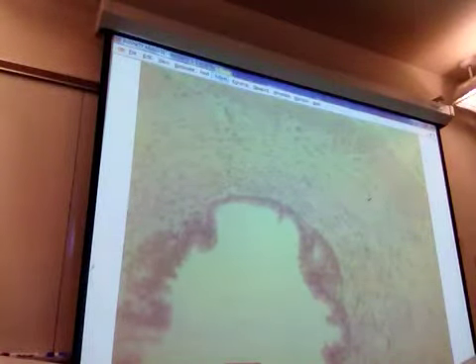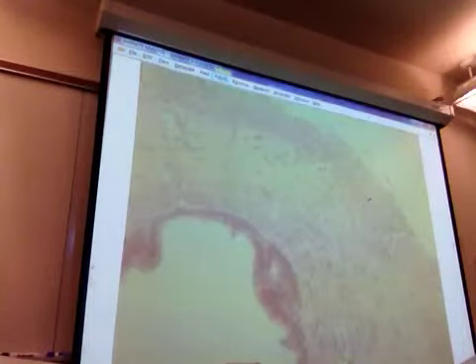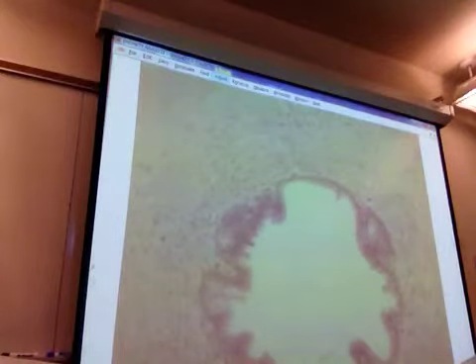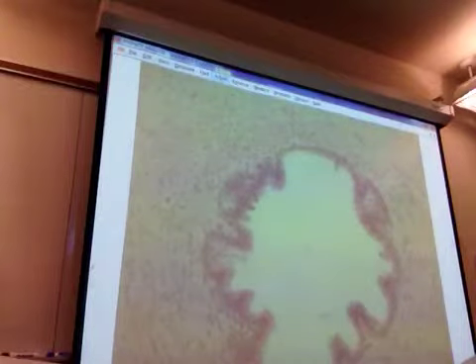Did you say it's the same epithelium as the epididymis? So it's ciliated? It transitions, but I think it's still pseudostratified, it's just whether or not it has cilia. It kind of turns into microvilli. Yeah, it kind of does, because you can see that brush border, especially on the top, like here.